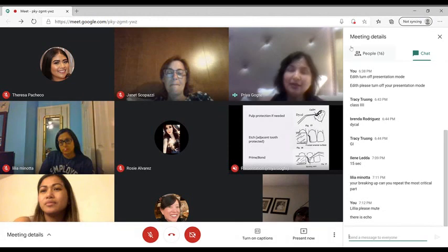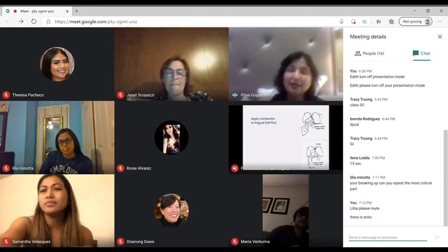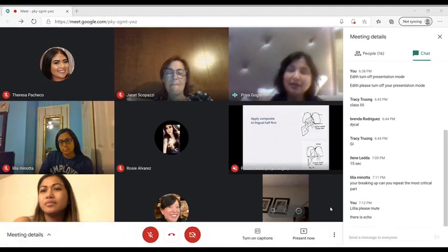And you can do different shades. You want to put a translucent shade in the back. In my slideshow I said transparent, but I don't mean transparent, I mean translucent shade. Translucent shade comes in light and dark.